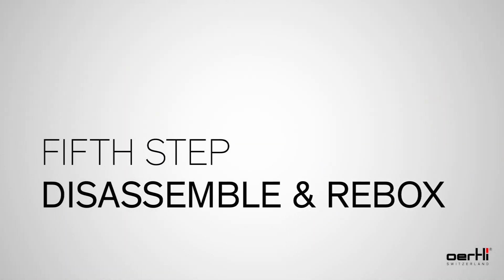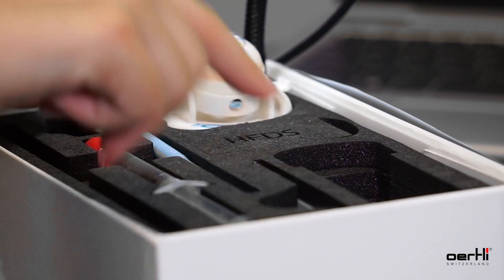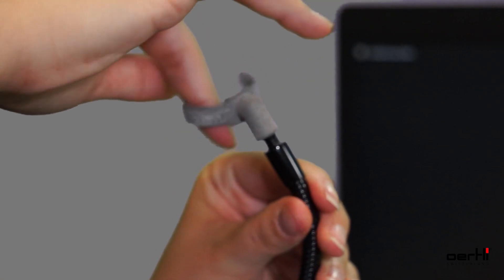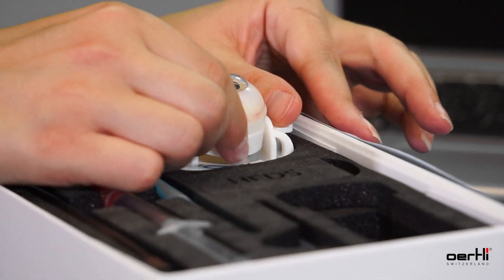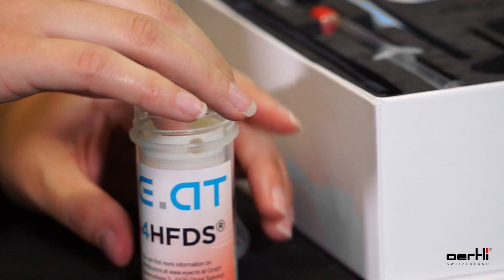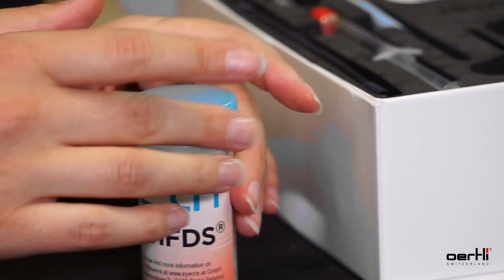Step 5: Disassemble and re-box. Important: clean the HFDS tip from visco residues before storing it in the box again. Separate all components and put them back into the foam. Put the HFDS eye back into the container. Important: store the eye in water to make them durable and to maintain the realistic appearance.